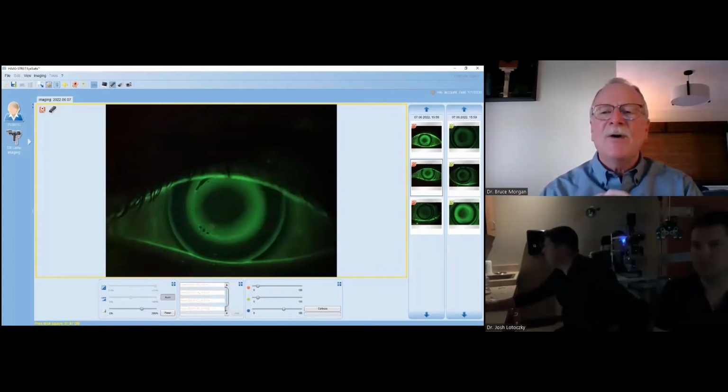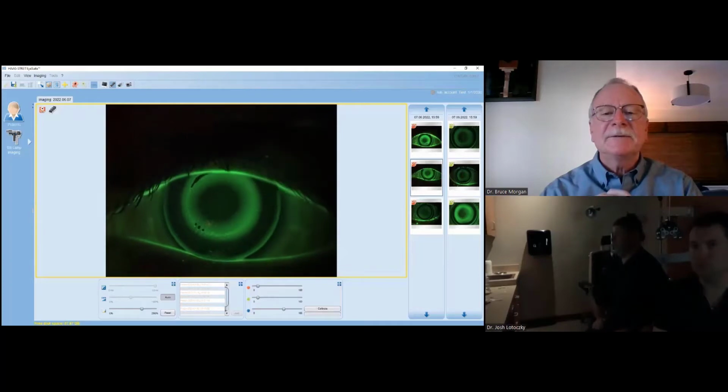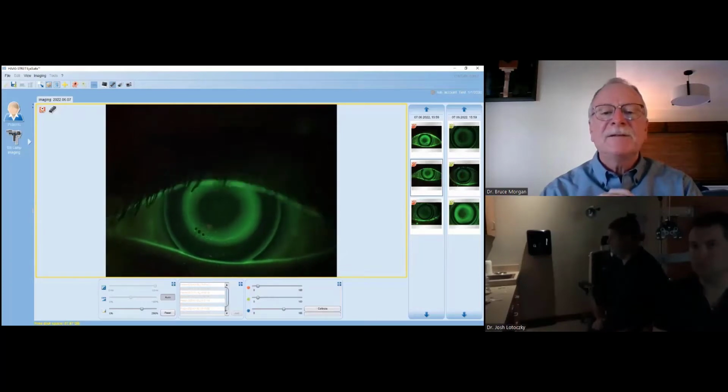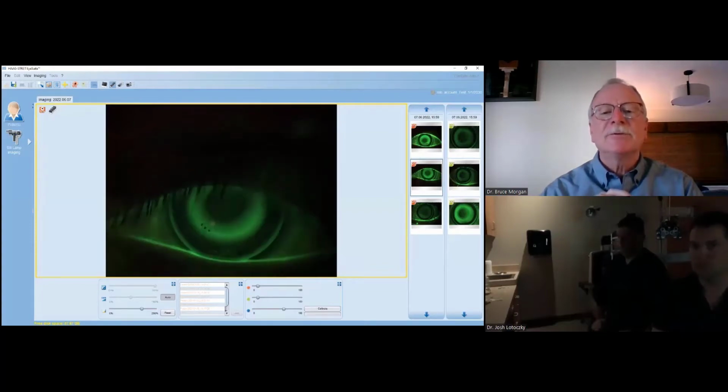Because the fluorescein pattern just does not always reveal what you're going to get. If it's looking generally like a nice bullseye and you're getting some treatment and you've got that nice peripheral ring, we can make decisions later that are going to be more informed for sure.